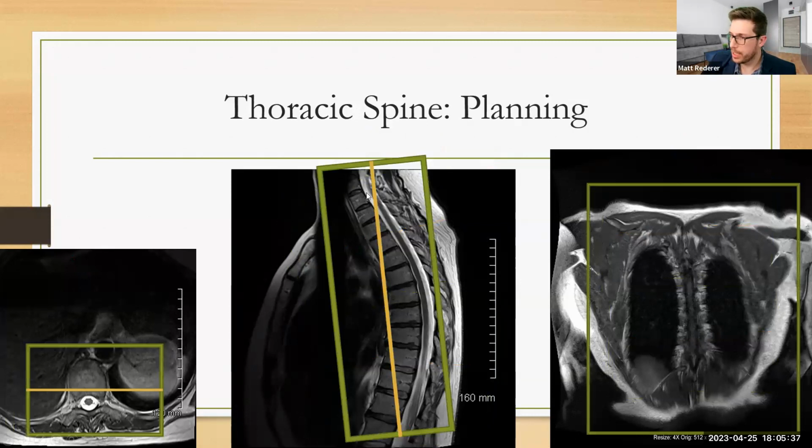All right. Here we've got a coronal image. We only do these for scoliosis, the same as the cervical spine. And we just cover the entire vertebrae, all those vertebrae from T1 all the way to T12. Some sites like you to get a little bit more. It's up to whatever your radiologist's like.